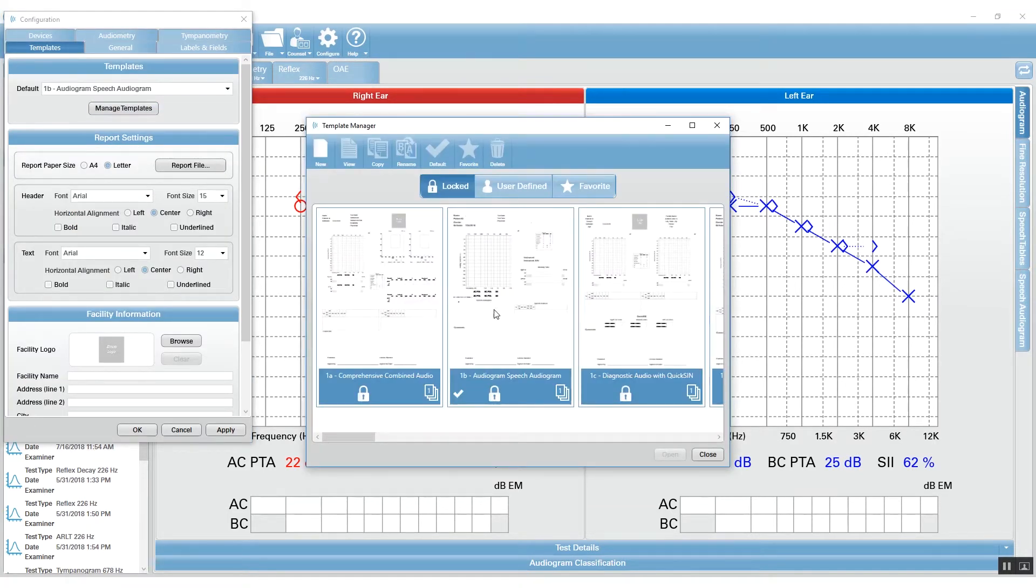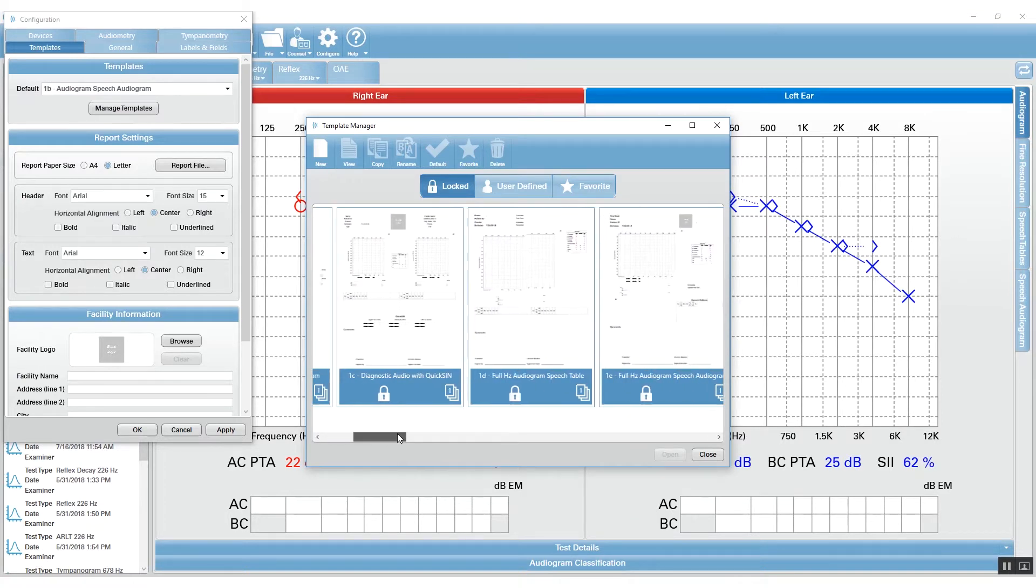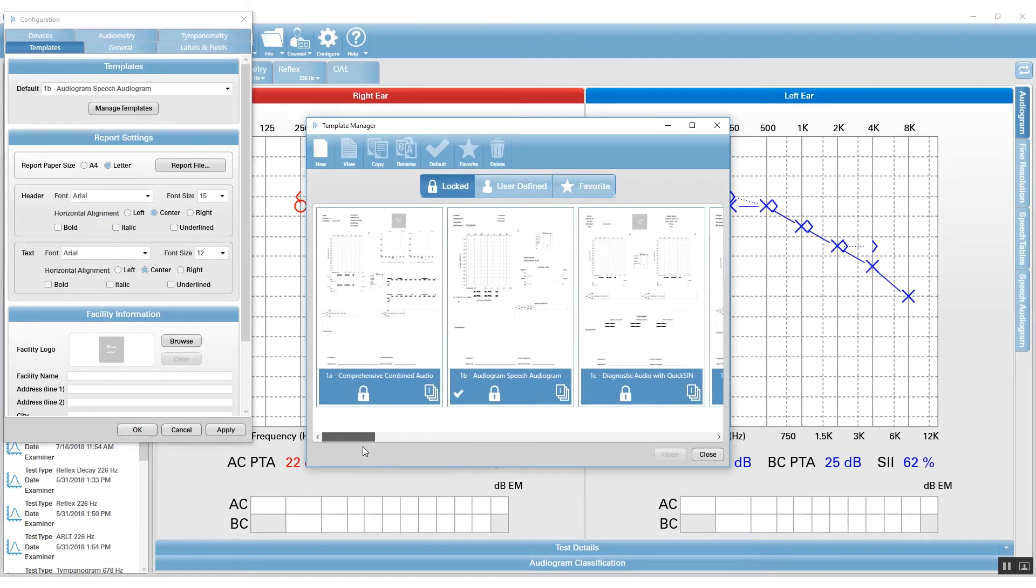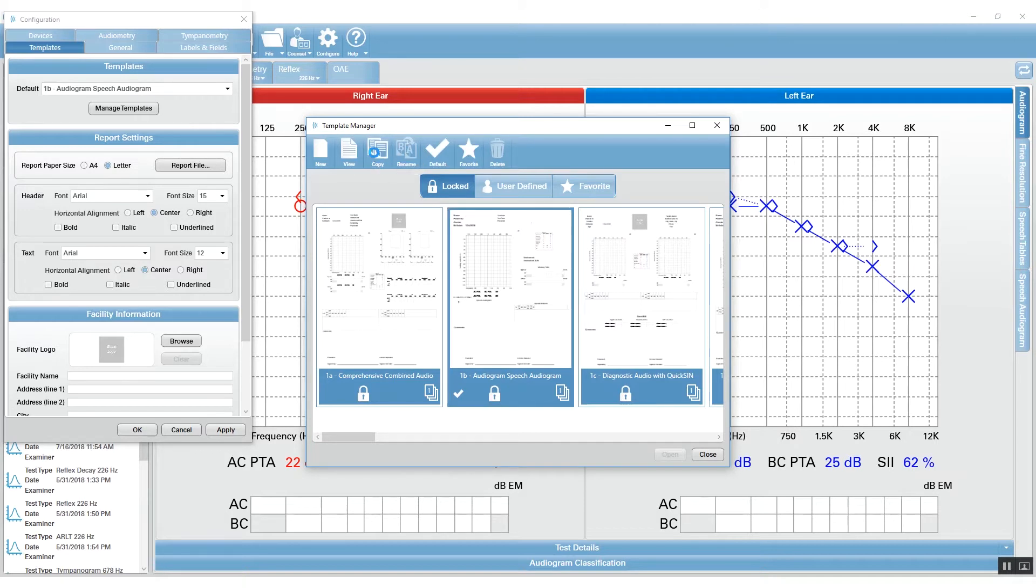Chances are you've perused these, maybe selected a report that you like, if only it were a little different. You can select the report that you'd like to change and then go to Copy.